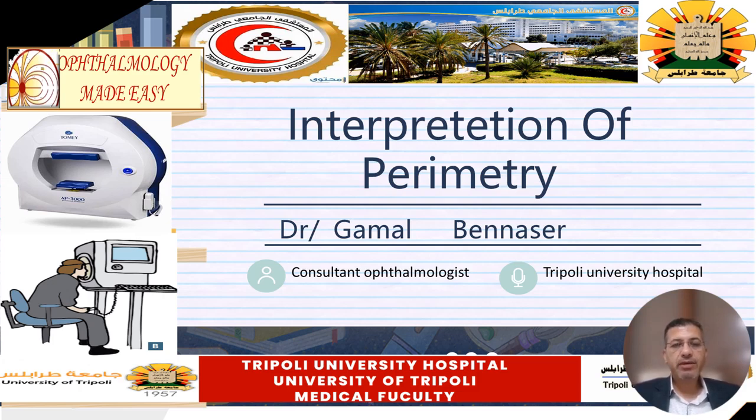And we will go deeper and read the different types of perimetry maps and plots. And I hope by the end of this lecture, you will enjoy it and find it very useful for you in your daily practice. We will start with the first slides.